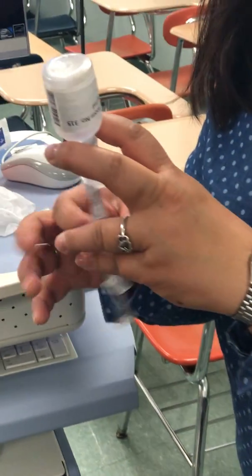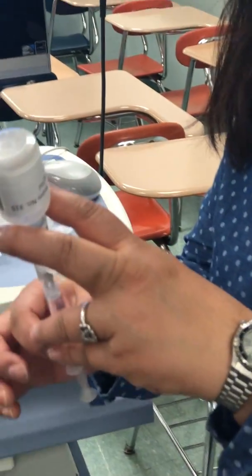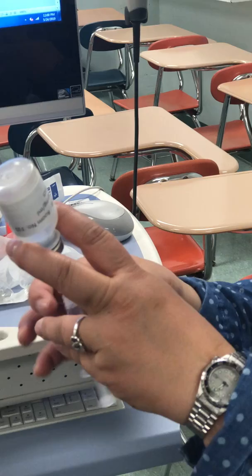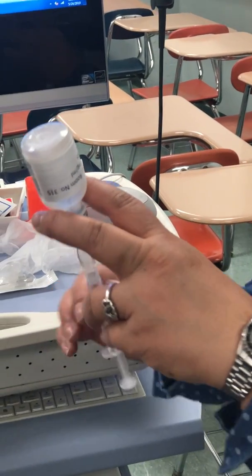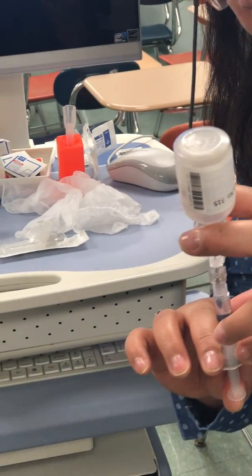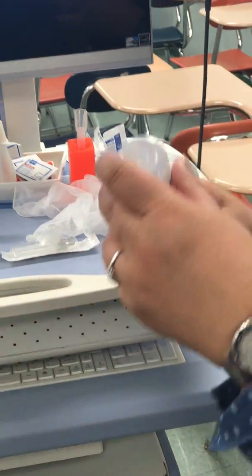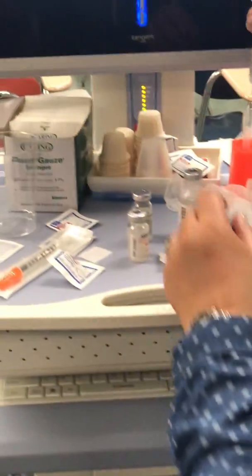So I usually put more than one and flick the syringe hard and push it back, all right? So like this. All right, so we are gonna go over here.